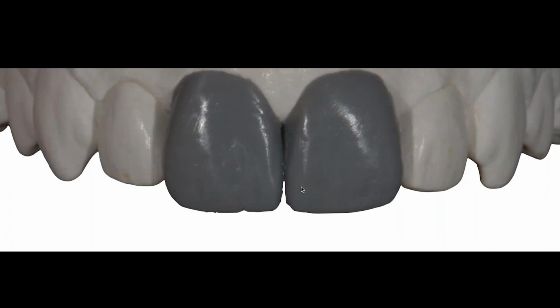What I really care about the most is those mesial line angles here and here. I don't care so much about this, and I don't care so much about that, because as we go to the right and left sides of the face, the teeth aren't exactly the same. But what I care about the most is that. I want to make sure my mesial line angles really highlight the same way.